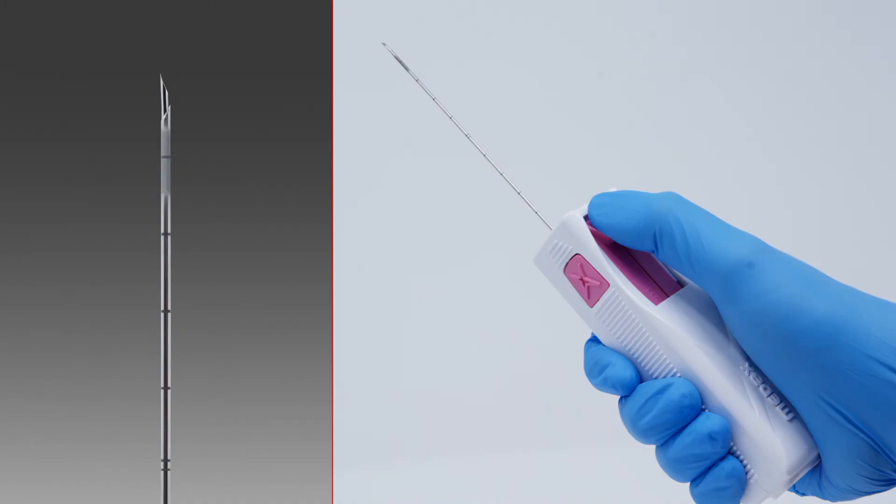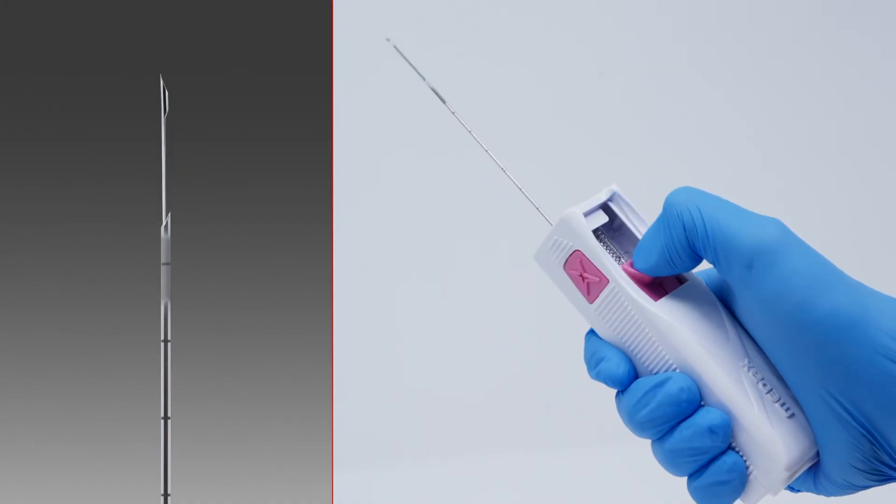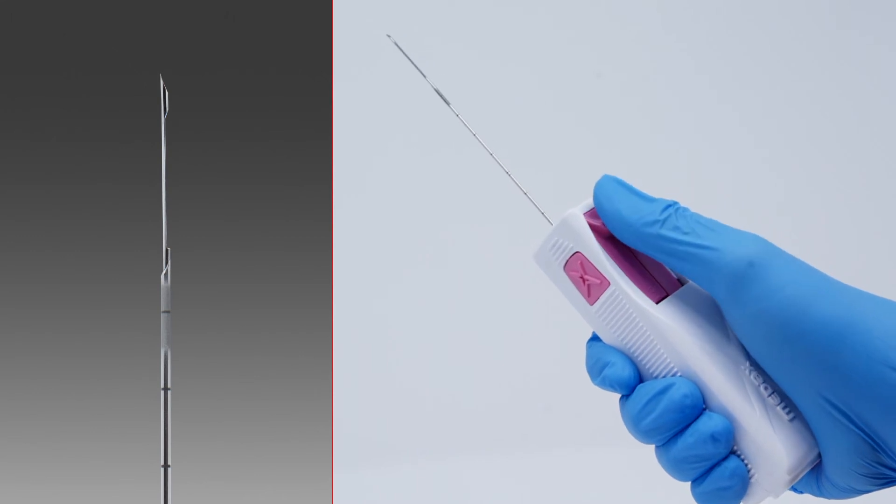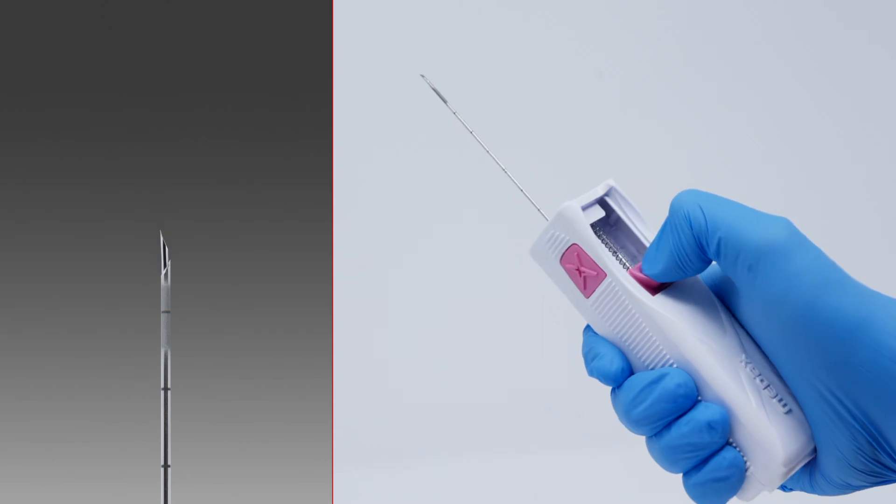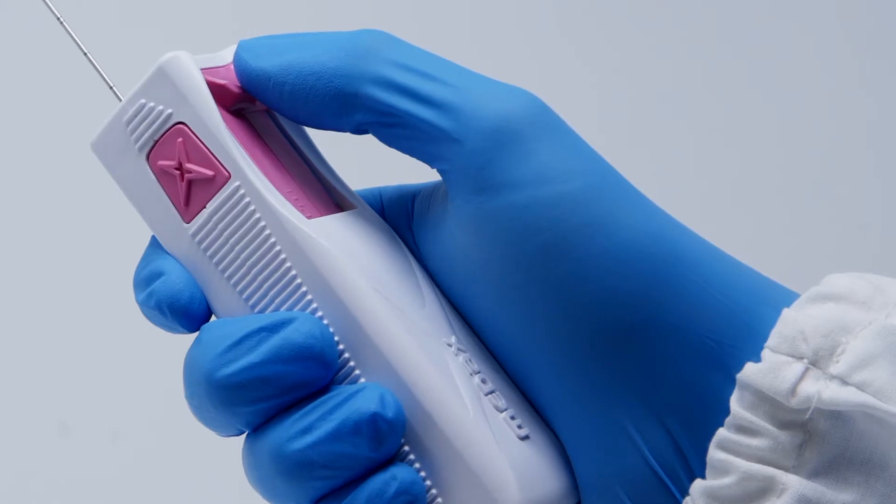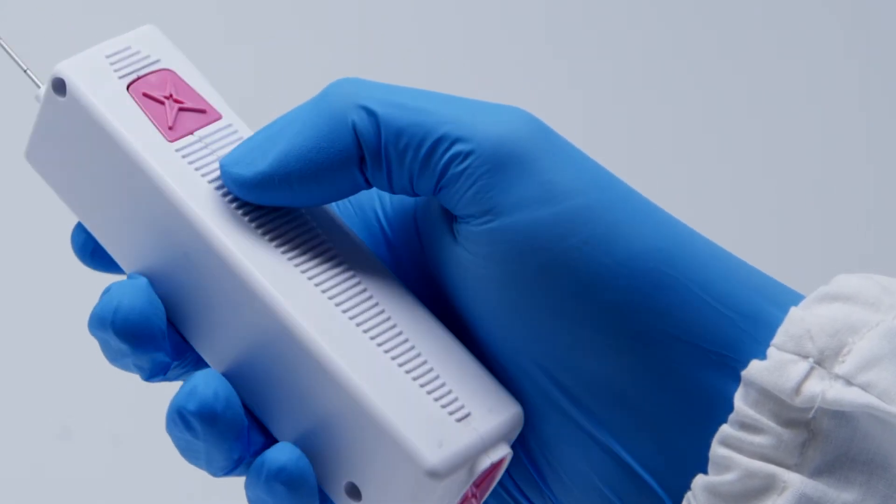Firmly hold the device and pull back the loading lever to load MedOne. Once to withdraw the cutting cannula and twice to withdraw the internal stylet. MedOne is now loaded and ready to use.